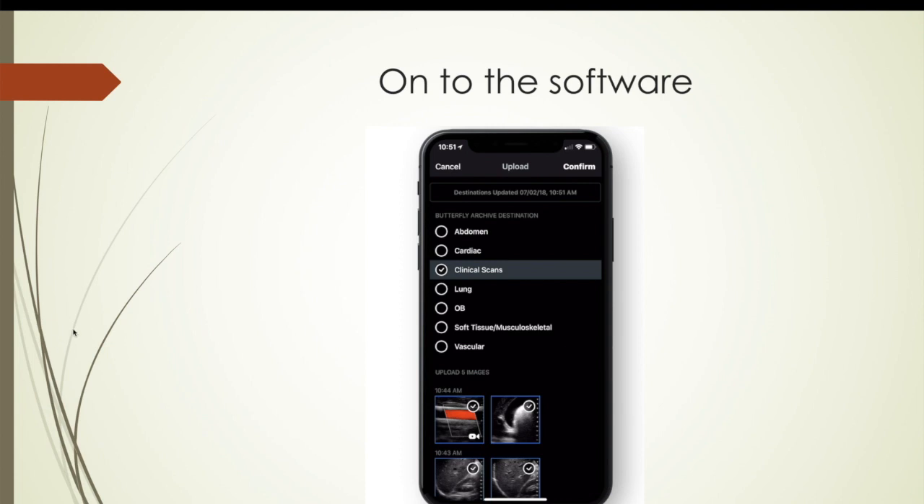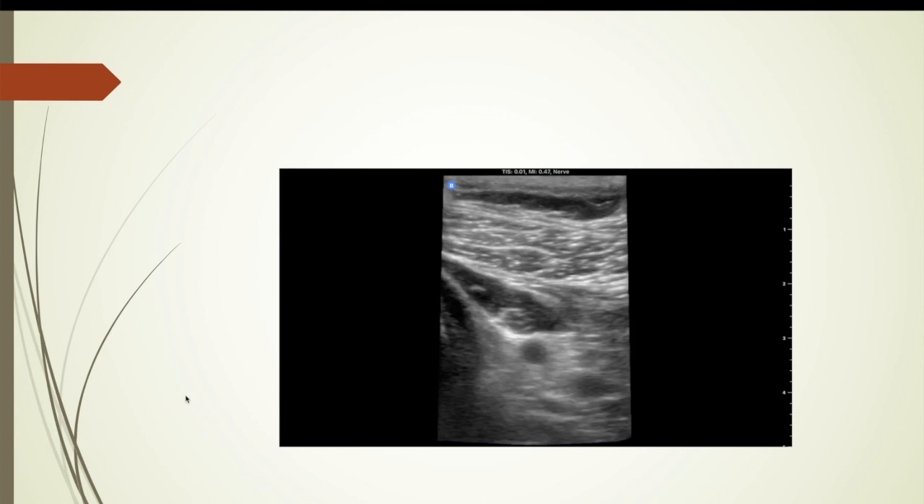The software is, in my opinion, one of just the most excellent parts of this — so easy to use yet so powerful. With one hand while using the probe, you can slide one thumb to change your contrast, change the depth. They just make it extremely easy, and it really elevates the machine and increases the capabilities.